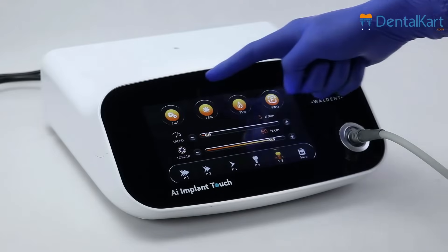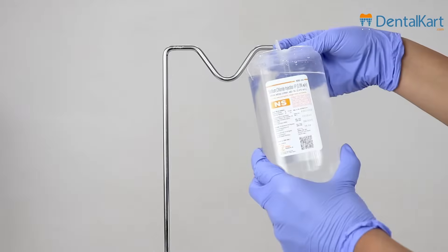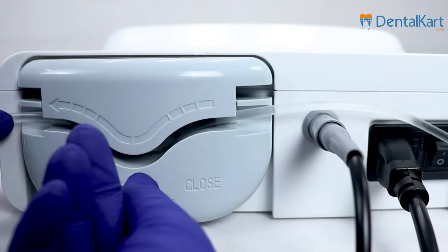As you can see, it uses a glass screen, which is easy to clean and maintain. Here's the Saline Bottle Bracket. The peristaltic pump is on the back — twist, there you go.